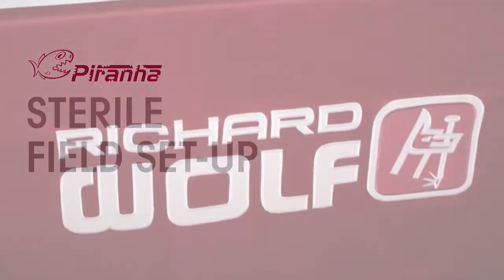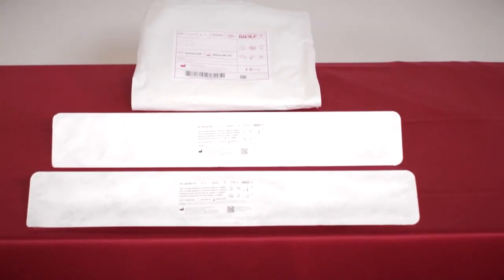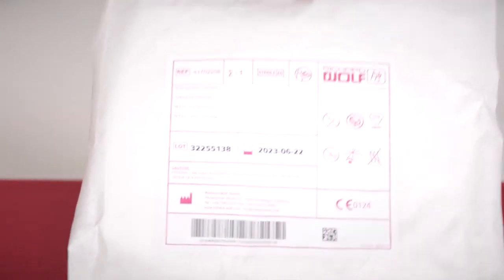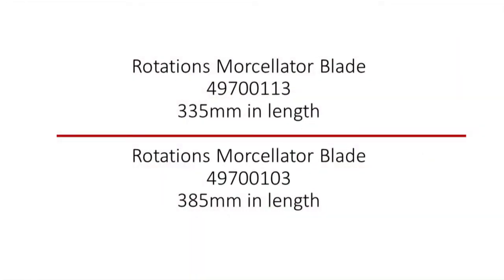To prepare the Piranha system for use, gather the following sterile items. Shown here is the sterile disposable tube set in its package. Also, Rotations Morcellator Blade 497-00113, 335mm in length, or Rotations Morcellator Blade 497-00103, 385mm in length.